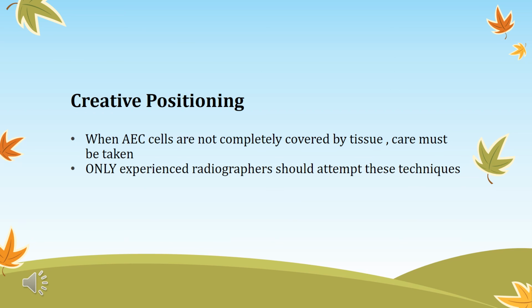Positioning. When AEC cells are not completely covered by the tissue, care must be taken. If a cell is partially covered by tissue, deactivation of the cell is recommended. However, if no cells are covered by normal tissue, creative technique must be used. Only experienced radiographers should attempt these techniques.